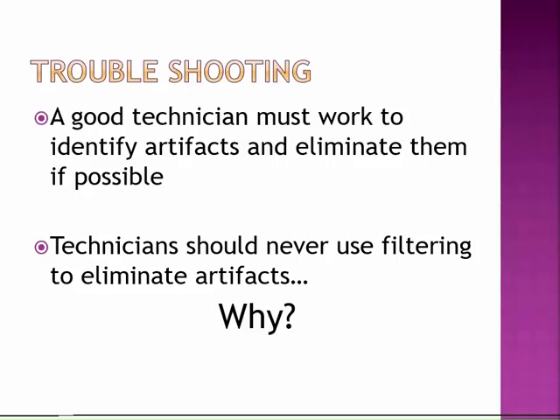Whenever possible, we don't want to use filters, because again, you're just putting a band-aid on a sloppy signal. So instead of trying to make it look pretty, get it looking pretty by doing a quality hookup. I can't stress this enough: how important the quality and integrity of our electrode application is and how much it directly relates to the quality and integrity of the sleep study recording.